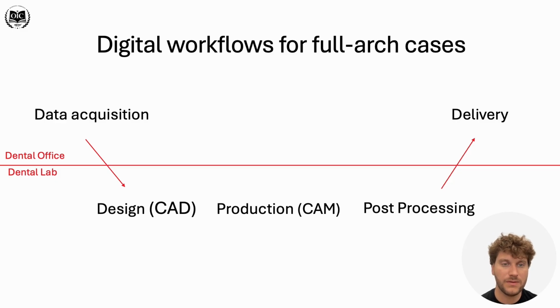In every step of this process, we can have errors, and we'll stick to the data acquisition appointment today. We'll talk about, in my mind, one of the two most important aspects that could influence the overall finished product of full arch implant restoration, that is data acquisition: bite registration and implant scan parts.